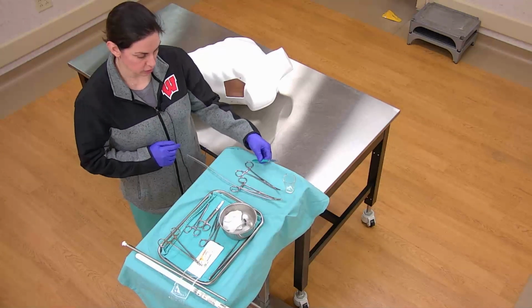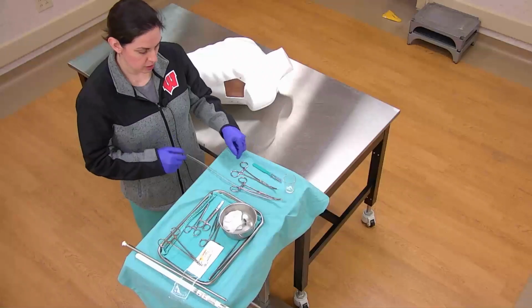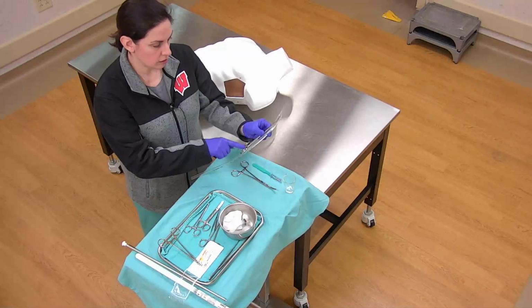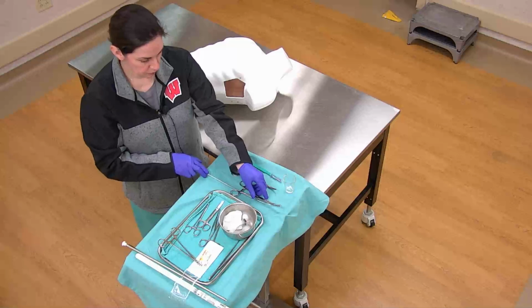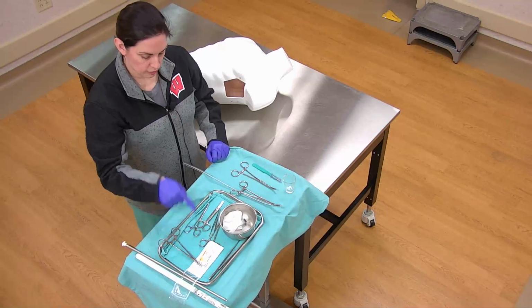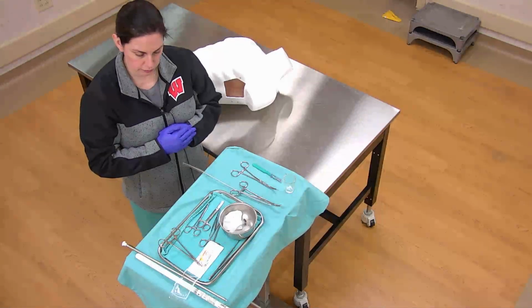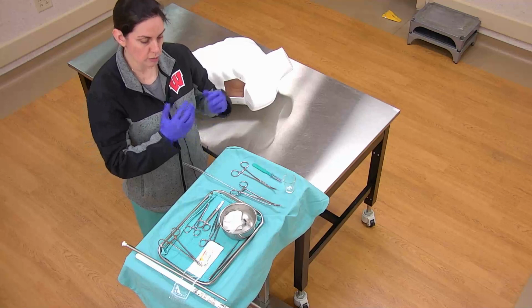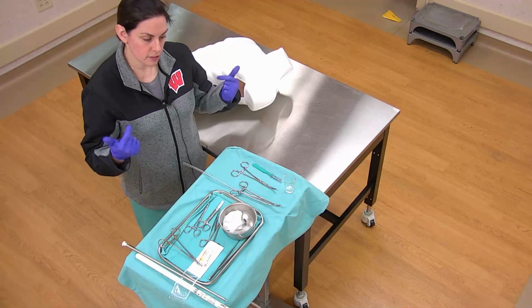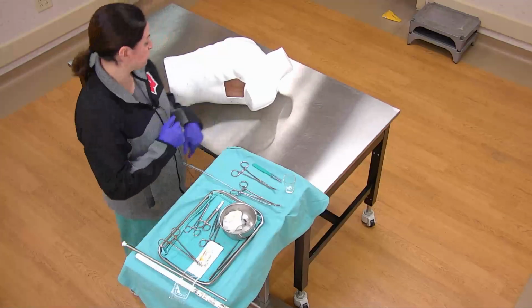You'll need a scalpel to make your incision, a blunt dissecting instrument, a chest tube, preferably preloaded with a clamp at the tip, a place to put sharps, a suture and driver to secure the tube in place, and sometimes pickups can be useful. For this demonstration, I'm just wearing standard gloves, but you should wear sterile gloves, a surgical gown, and a bouffant or equivalent.